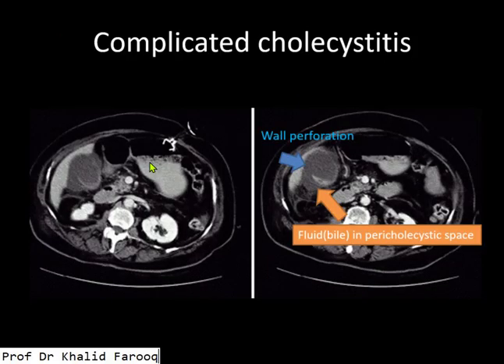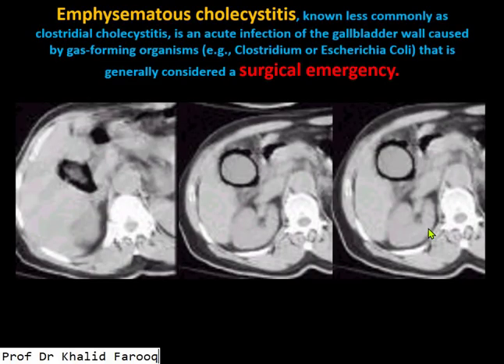Here we see a complicated cholecystitis where there is perforation of the wall of the gallbladder and bile is extravasated. Complicated cases can be assessed with the help of ultrasound and CT, but CT is the better modality for their assessment. This is an example of emphysematous cholecystitis, which is basically a surgical emergency and is produced by gas-forming organisms.